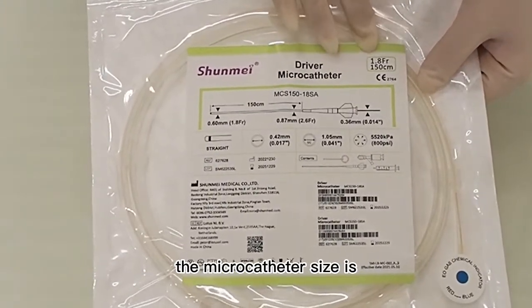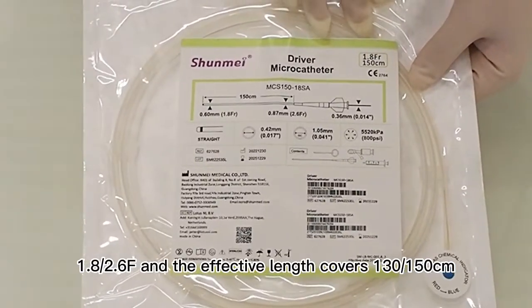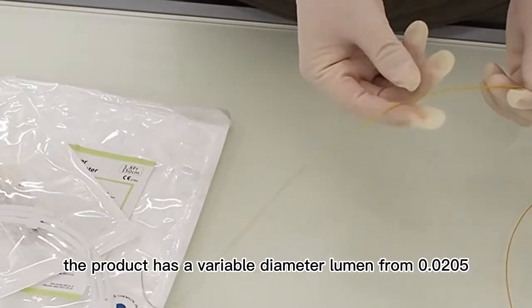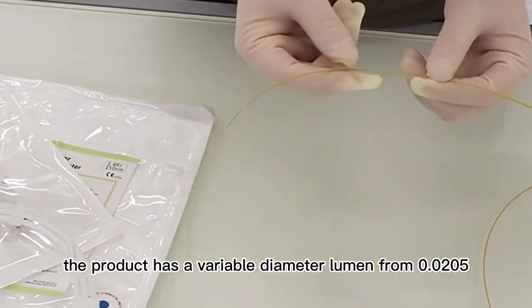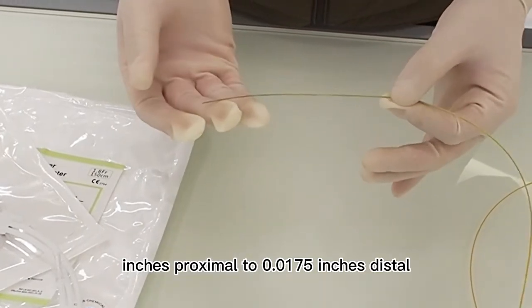The microcatheter size is 1.8–2.6F and the effective length covers 130–150cm. The product has a variable diameter lumen from 0.0205 inches proximal to 0.0175 inches distal.